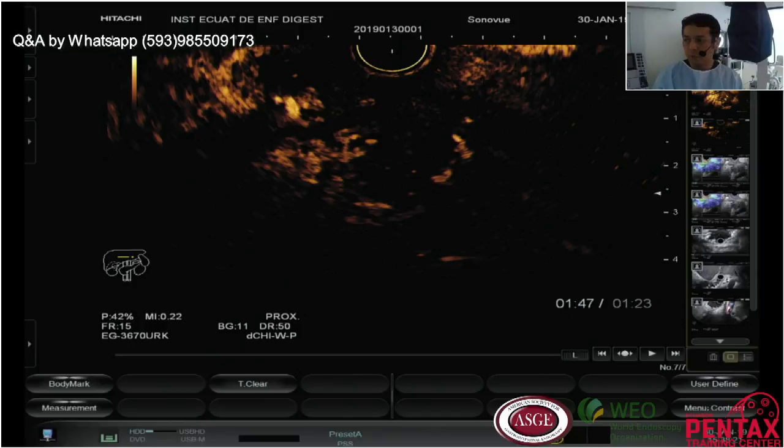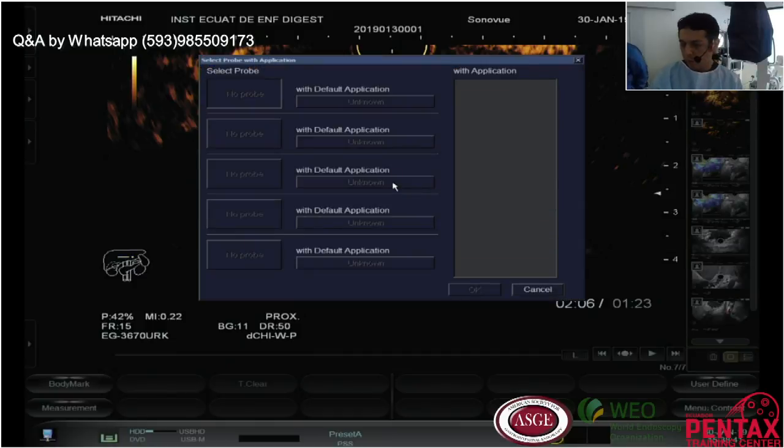I will use a 22 gauge needle because I cannot use the same needle to perform my aspiration of the mass and then to perform my neurolysis. So I will use also for my neurolysis a 19 gauge standard needle, with bupivacaine, 10 ml, and 10 ml of absolute alcohol, 99%, 98%.